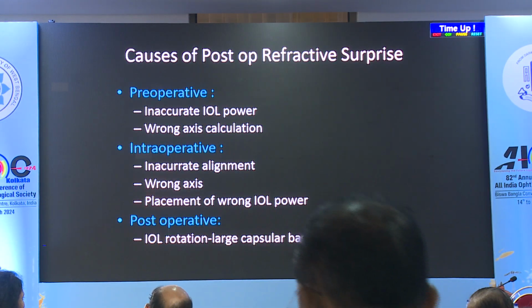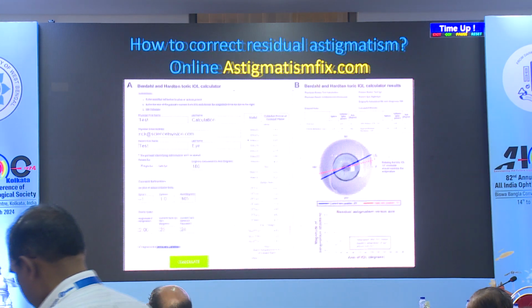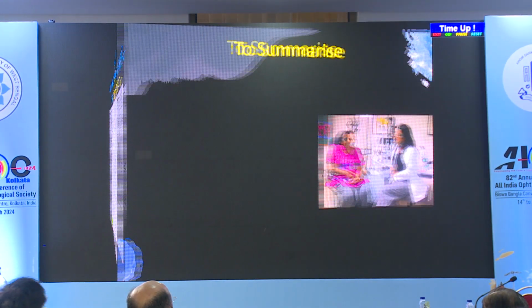So post-op refractive surprise, just know it could be because of any of these factors. Just know that astigmatismfix.com really makes it very easy for you. Till the time we haven't used it, it seems like a very big deal, but you can just manipulate and create a situation in your OPD and just play with it one or two times. Pretend that the patient has a surprise and put in the readings, and the machine will very easily tell you how to rotate and where to put the axis.